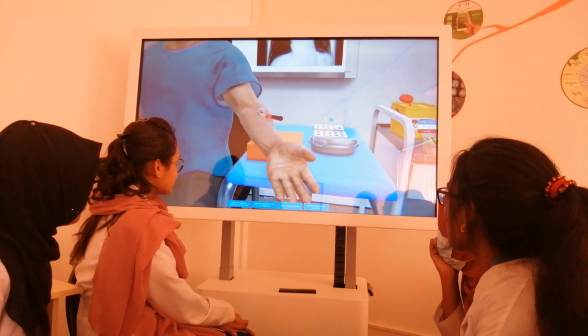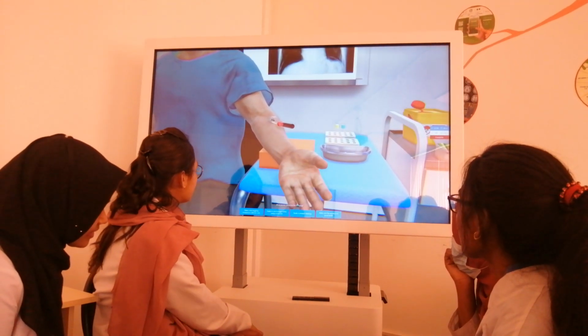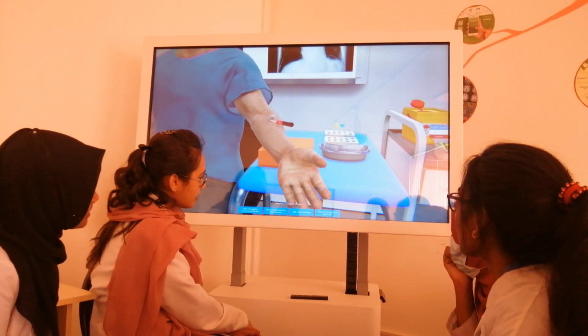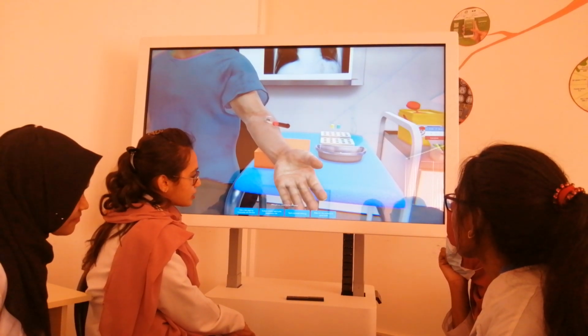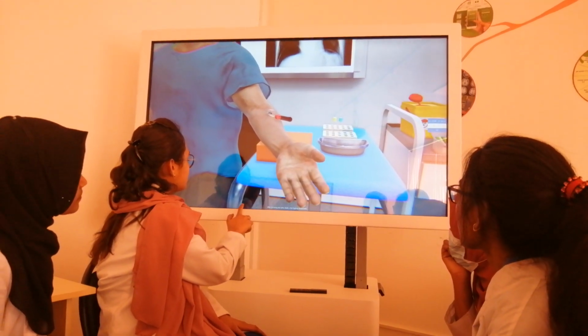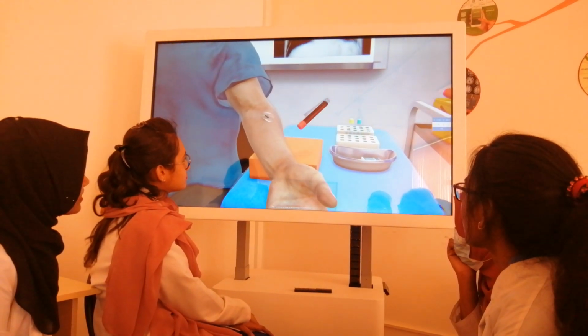What process should be the following? Make a few wiggling movements with the tube. Apply an alcohol wipe to the vein puncture site. Apply a pressure dressing. Make sure the patient is in good health. After removing the tube, make a few wiggling movements.